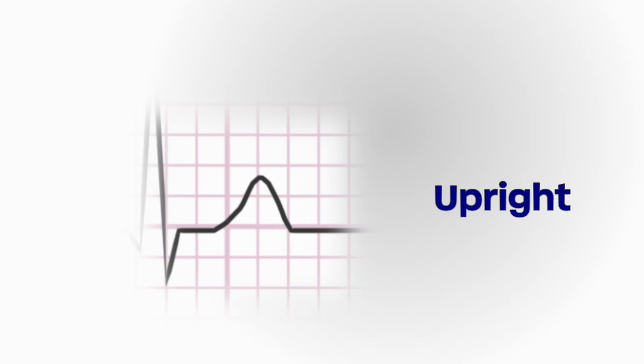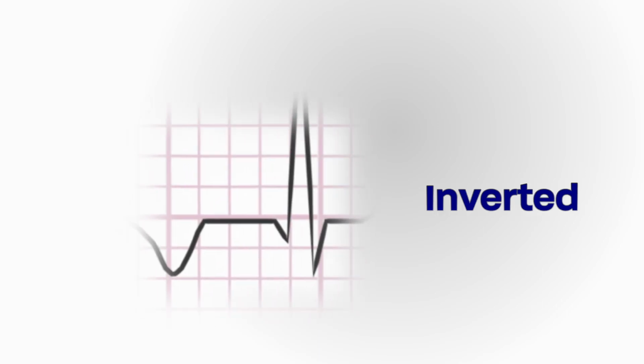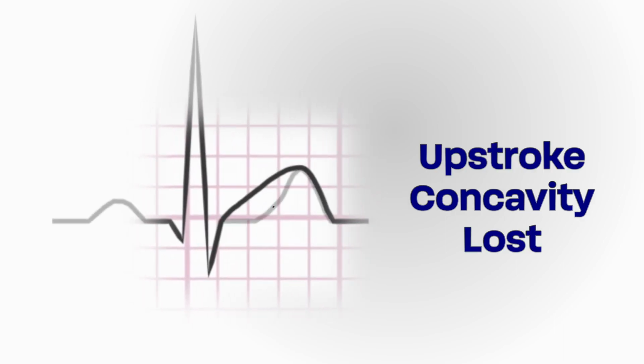Finally, the T wave is rounded, nearly always upright in normal situations, and will always follow a QRS complex. A T wave can't exist by itself. These are normally taller than the P wave, but will be shorter than the QRS complex unless there is something wrong. The slope should be more shallow on the upstroke side than on the downstroke side, and changes to the shape of the upslope of the T wave are early indicators of myocardial damage in, for example, the context of ischemia. That definitely gets its own video at some point.